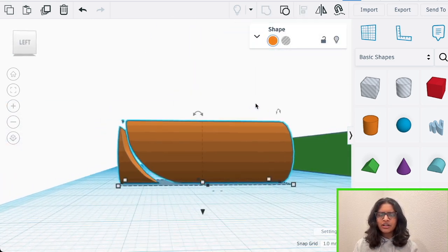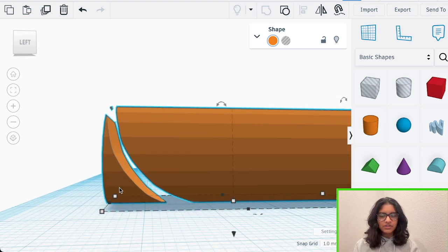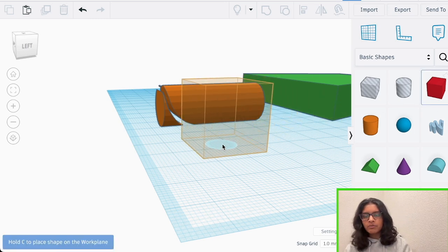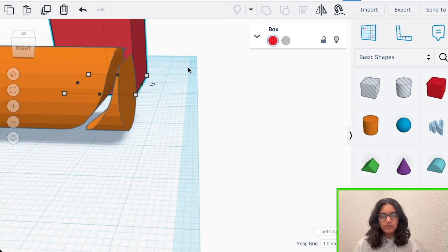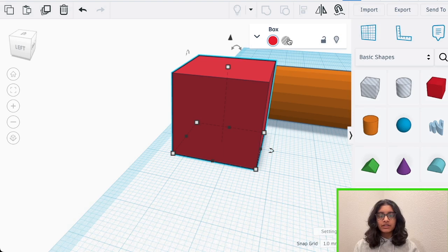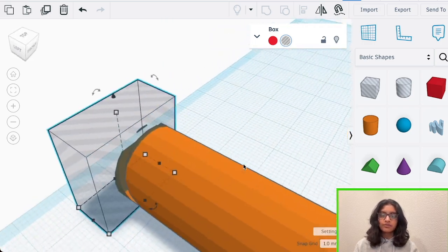So now I've got kind of an outline of my finger shape, but all of this extra stuff is totally unnecessary. So the way I'm going to get rid of it is I'm just going to drag and drop a few different types of shapes to try to fill in this extra piece we have to our finger. I found that cubes and triangles are the most useful for this. So basically I'm just going to make all of these objects a whole and then try to fit it into all these extra pieces that I want to get rid of.